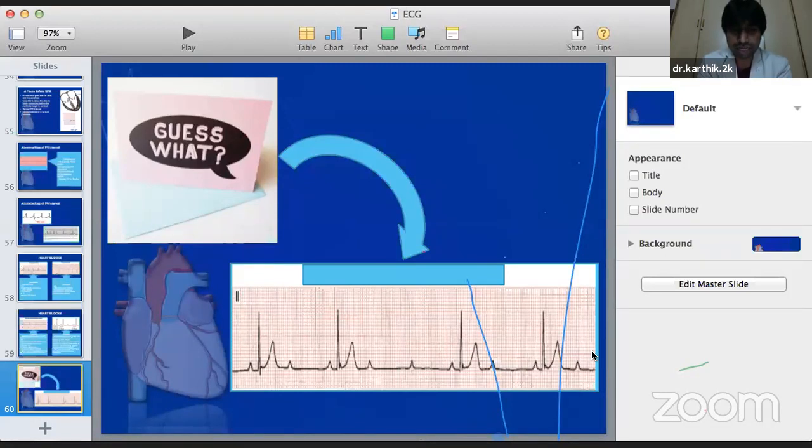Whereas when there is an isolated chamber enlargement, for example, more importantly, right atrial enlargement secondary to pulmonary hypertension and long-standing COPD, where only the height of the P wave becomes very tall, it indicates that the right atrial chamber has dilated to a great extent.